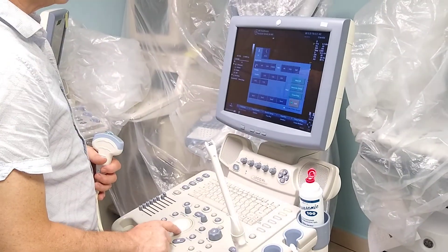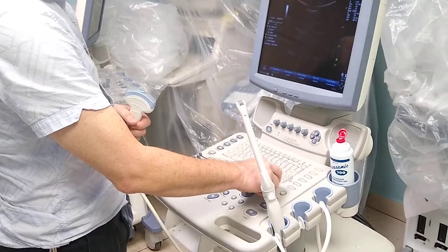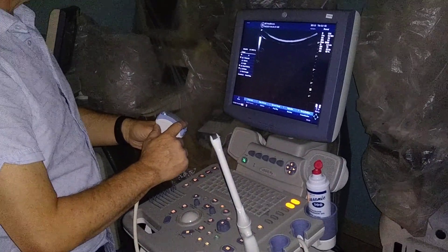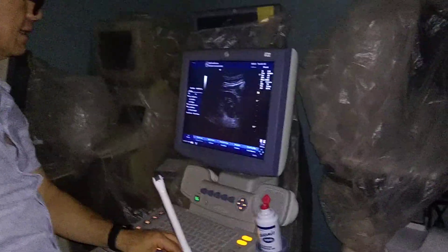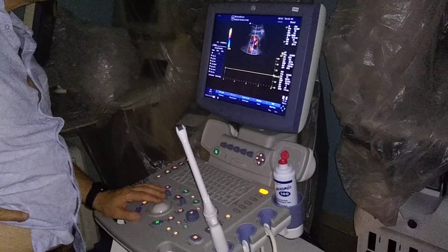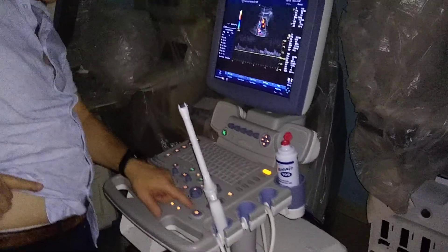Now I am going to go to abdominal. First of all, let me go to low, very low. Not a single crystal broken. Let's see my kidney. Let me go to color and PW. Let's go to V again.